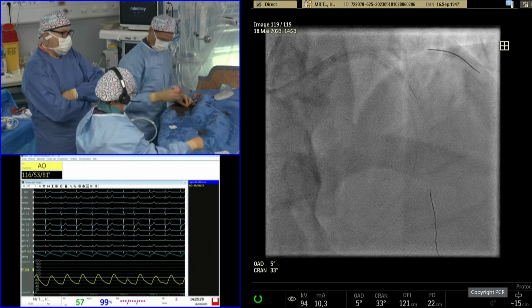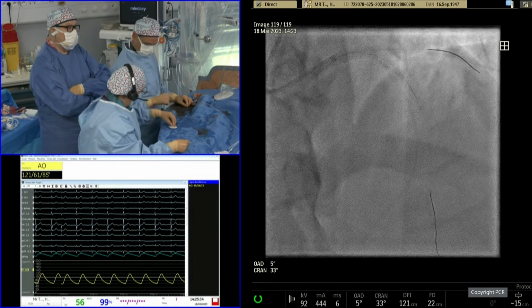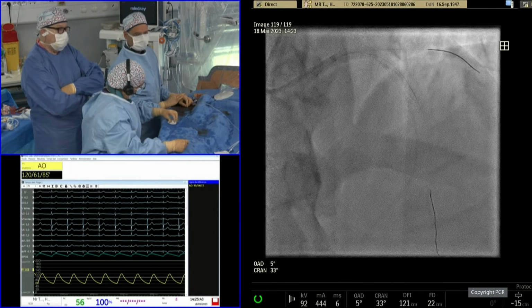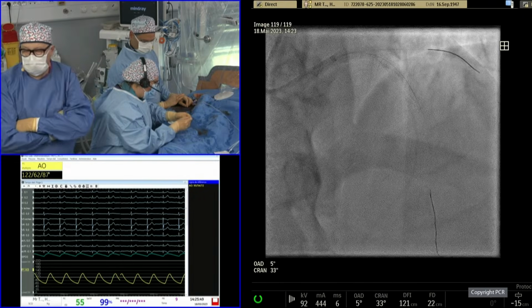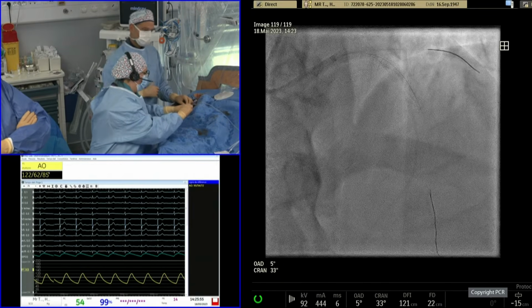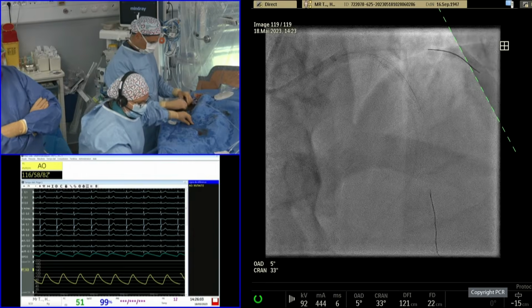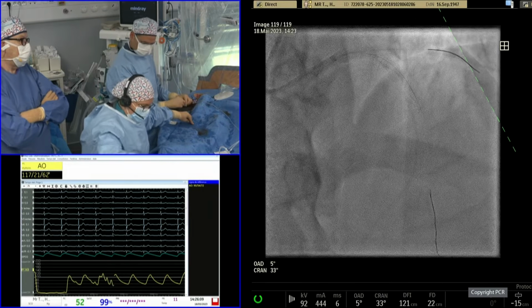Yeah, and the length of evaluation with OFDI is significantly improved. The software allows you to extend up to 150 millimeters. So there's a huge amount of customization available within the Terumo OFDI system, allowing you to go short to long. Here, the long pullback would be useful in the initial morphology assessment pre. Now we probably want higher resolution, so I'd imagine that Yoshi is bringing down the length of acquisition to achieve the greatest amount of resolution of the stent within both the proximal left main and the LAD. He will evaluate definitely both stents with the same run.